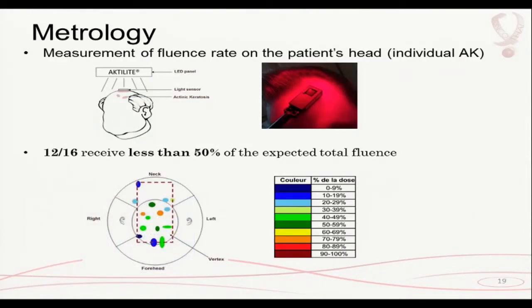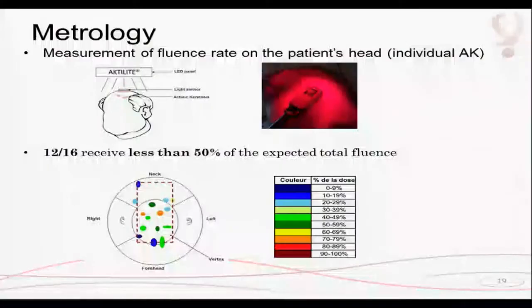So we had several clinical evaluations in progress in Lille, and that's a study performed by one of our residents, Claire. I think she was there the last 2 days. We're going to publish that because it's so simple, but I never saw this published. So, we asked an expert dermatologist, an expert in PDT, to apply these LED panels on the head. And what we did, we took a power meter.